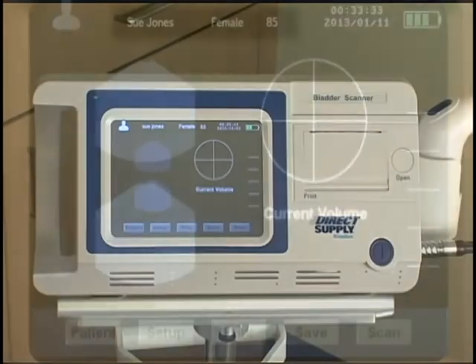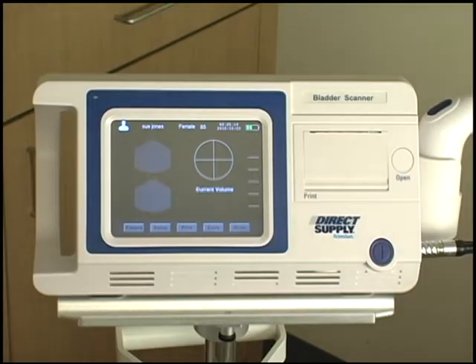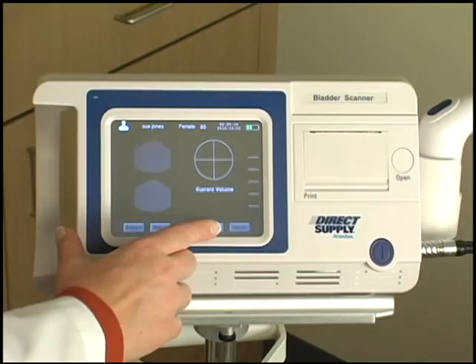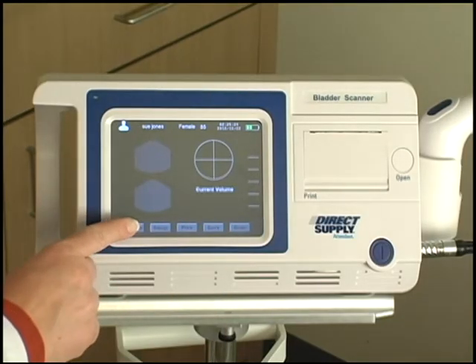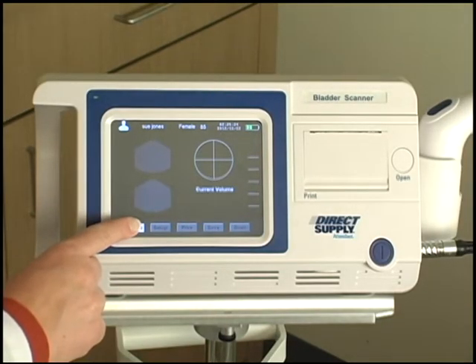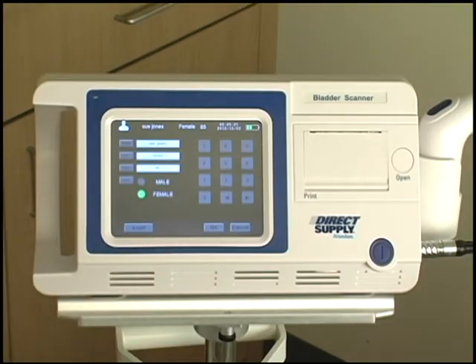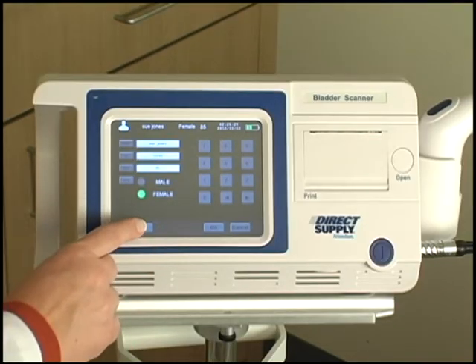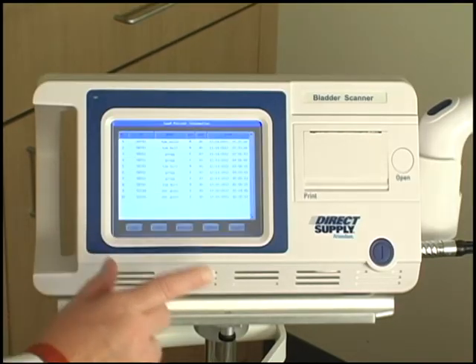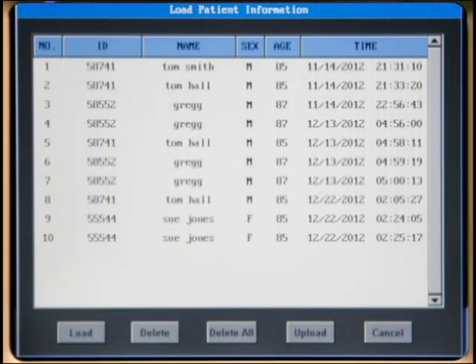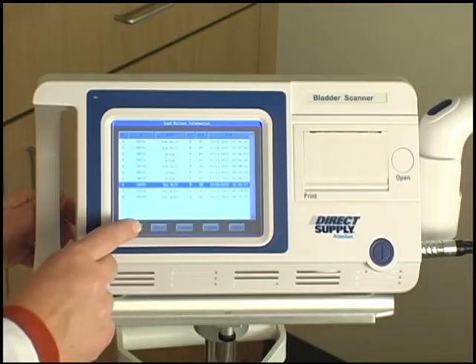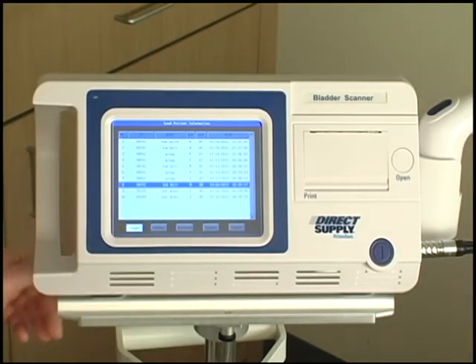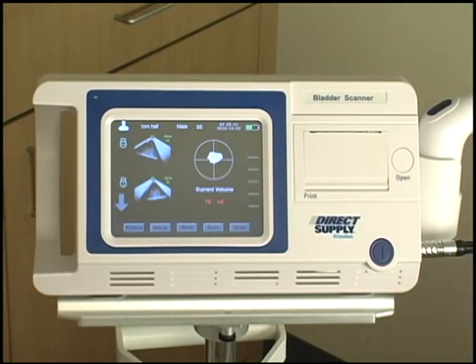To save the resident data in the record management system, press the save button. You can view these records by returning to the patient information menu by pressing the patient button. Then press the load button to display all the stored records. To view a patient's record, select their name from the load patient information list and press the load button. This will bring up their most recent scan for your viewing.